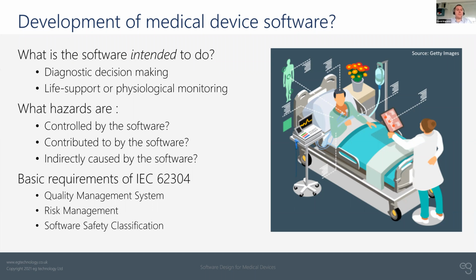The question is really where the boundary lies between medical device and health software, but this is where you always need to take a step back and make sure you're very clear about your intended use. And what I would encourage you to do as the very first step is to try and write down that intended use. If you're applying to the FDA and also as part of a medical device regulation application, you need to be very clear about what your product does, and the action of writing down what that intended use is in a short 1 or 2 paragraphs can be a lot harder than you think.